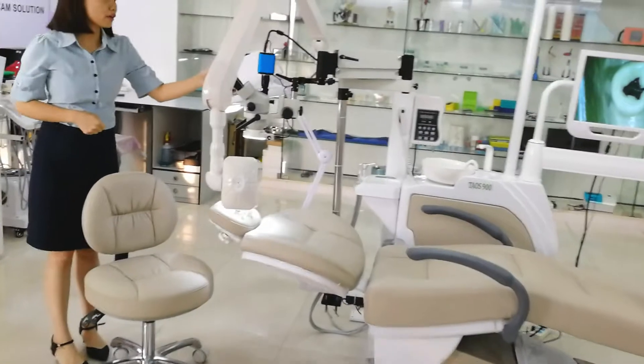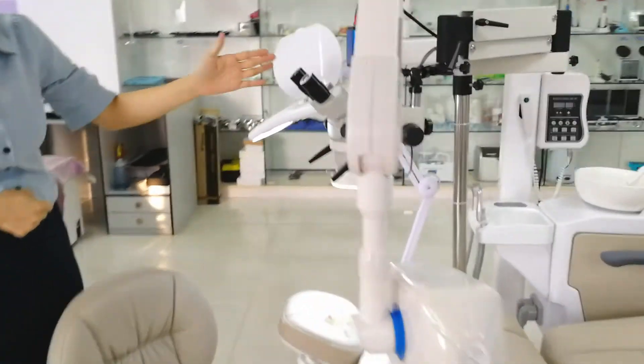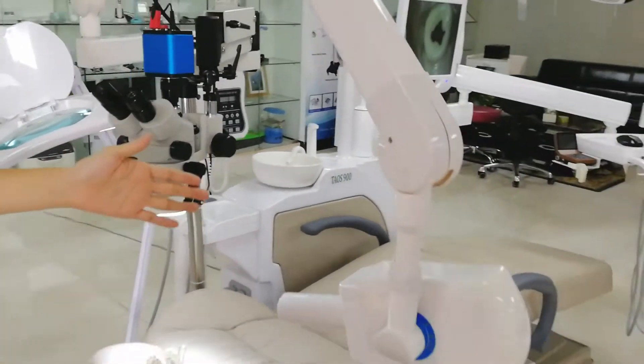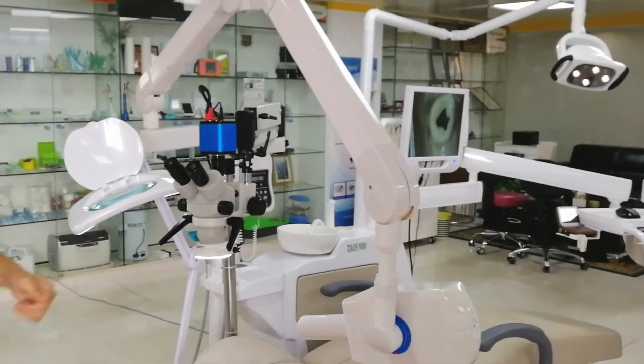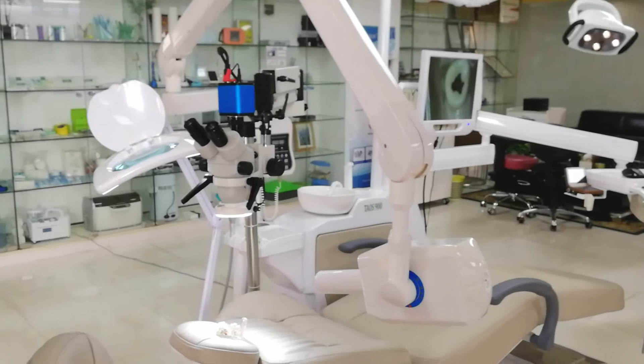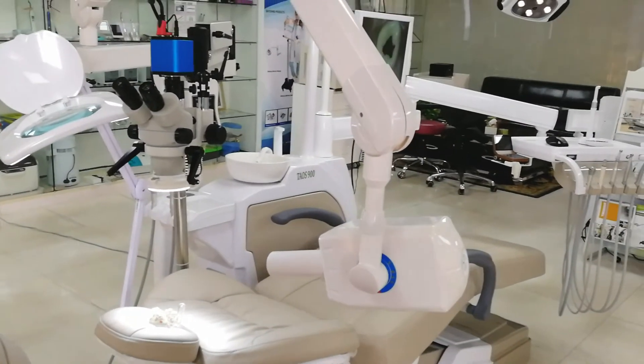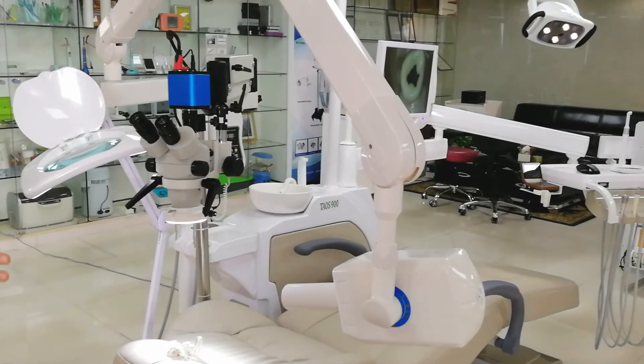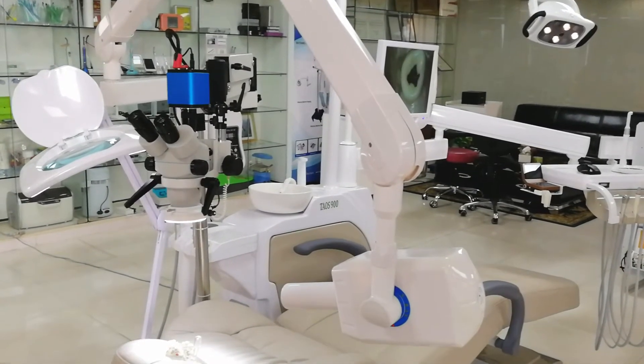This is the built-in microscope — it makes any operation easy. And this is the built-in x-ray. The patients do not need to move to another room; they just keep staying in the same chair. Of course, the room will be separated by the lead.